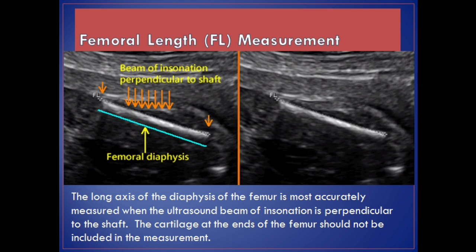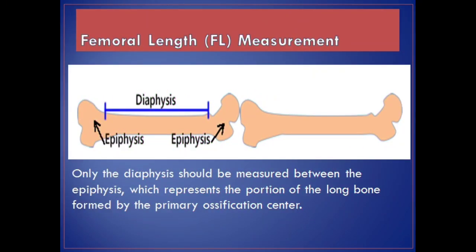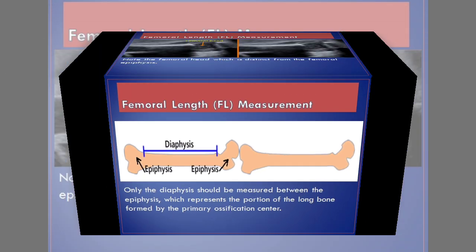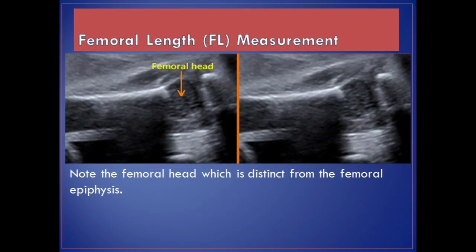Femoral length, FL, measurement. The long axis of the diaphysis of the femur is most accurately measured when the ultrasound beam inclination is perpendicular to the shaft. The cartilage at the ends of the femur should not be included in the measurement. Only the diaphysis should be measured between the epiphyses, which represents the portion of the long bone formed by the primary ossification center. Note the femoral head, which is distinct from the femoral epiphysis.